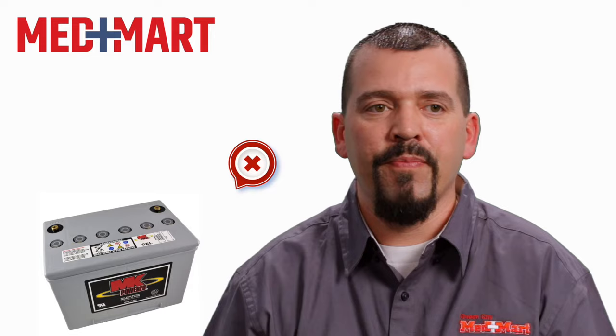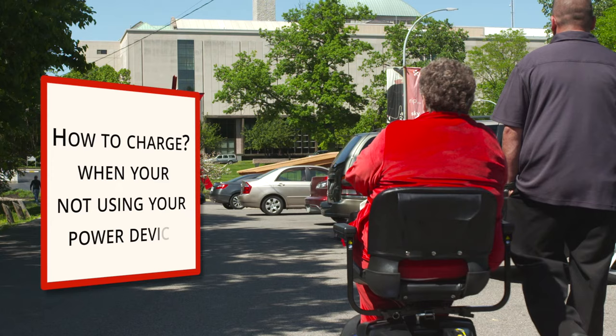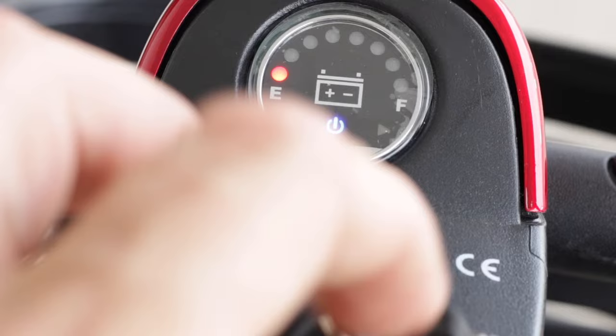There's a fine line on the proper way to charge your mobility device based on how you're using it. If you're not using your scooter that often — let's say you're parking it and only using it once a month or less — a good rule of thumb is to charge it once a month, once every three to four weeks. Give it a good overnight, 10 to 12 hour charge.